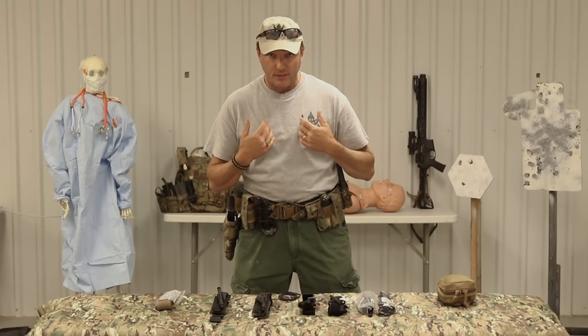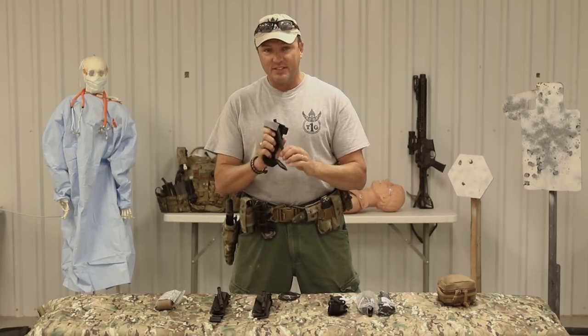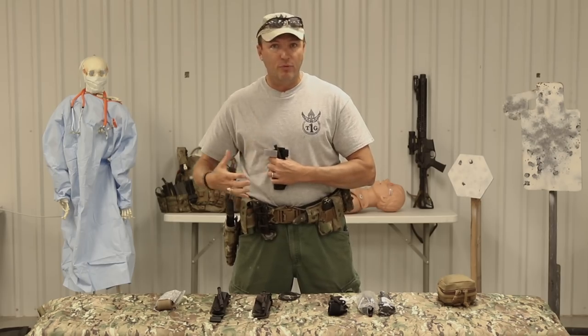My personal opinion: for self-treatment, you want to use the new CAT-T - the one that's got the plastic windlass on it. No matter which one you use, you need to mount it center at the front of your kit so that you can reach it with both hands.